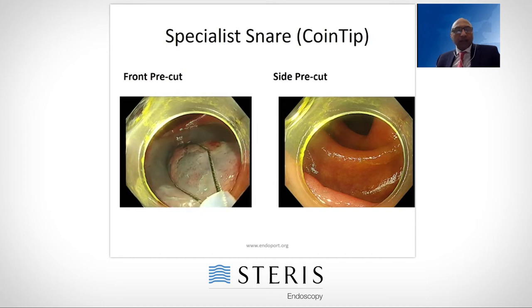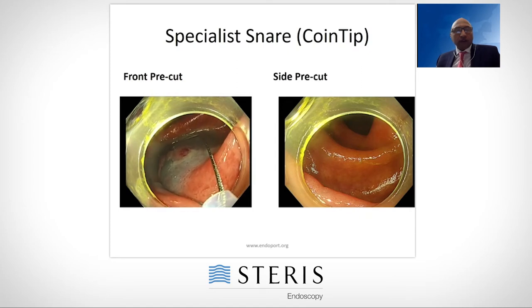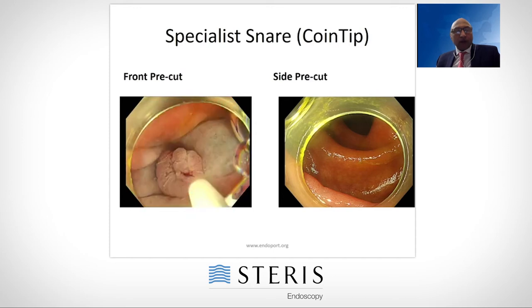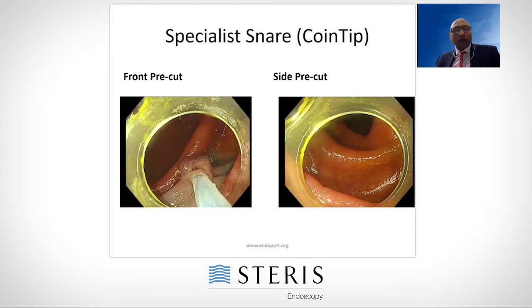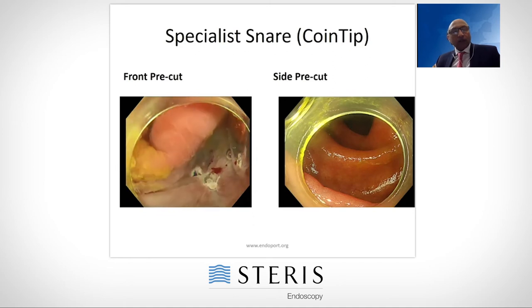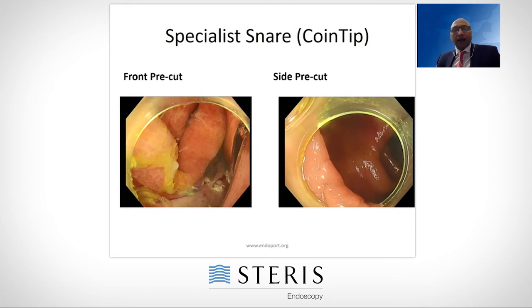I use that pre-cut to hook my snare, use it as a bevel, and then slowly open more and more and push. This is the right size now — I can start closing. I know that I can get the entire polyp in one bite. There — I got the entire polyp in one single bite, and now I can easily do cold polypectomy. There you go. So a hot pre-cut to start with, but then capture the entire polyp in one bite — a very good outcome.